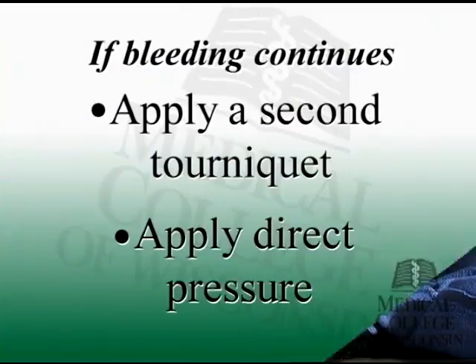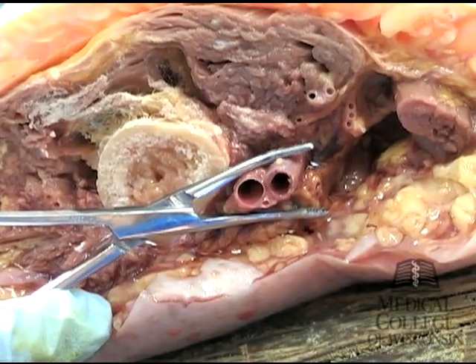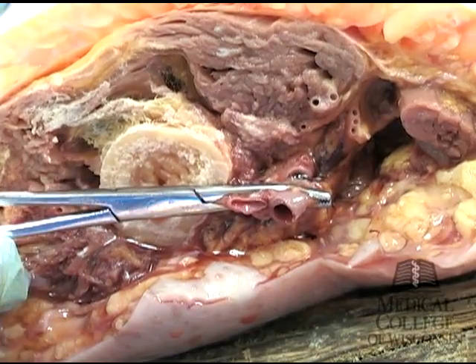If you have further bleeding at this point, the first step is to apply a second tourniquet either above or below the first tourniquet, depending on how much space there is on the limb. If bleeding continues, direct pressure is applied over the site of the bleeding. If that is not possible, selective clamping of bleeding vessels using a Kelly clamp is used as a last resort.